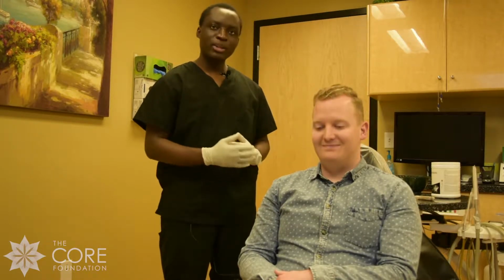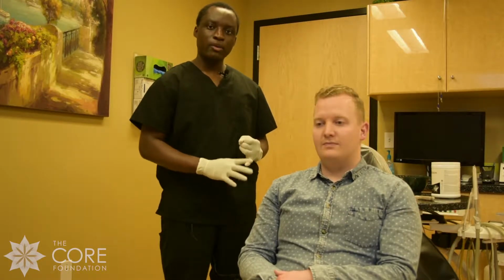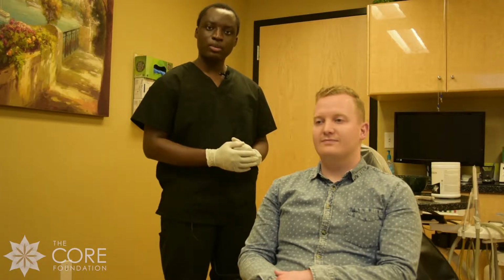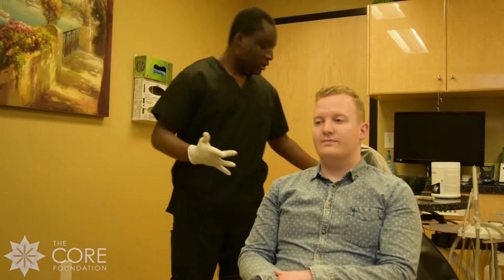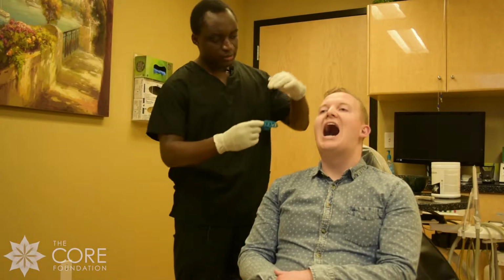He's going to help me demonstrate to you how to properly size up a tray for an impression, and also I'll show you some different techniques to get a better impression each time. First tray that we're going to do is a small tray. Now go ahead and open, Jason.